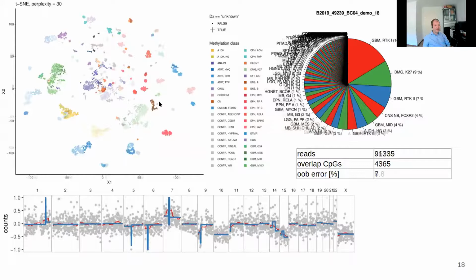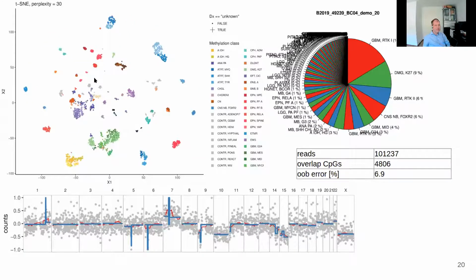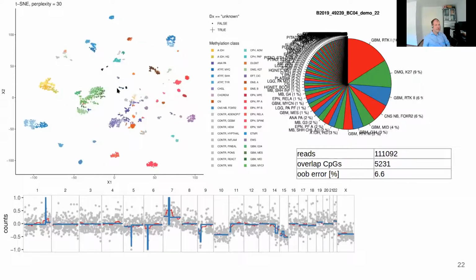And that's the same reference samples that are used in the German Cancer Research Brain Tumor Classifier Center. And in the end, you end up with a diagnosis with a copy number plot: chromosome 7 EGFR amplification, P16 deletion, loss of heterozygosity of chromosome 10, and here that green cloud would be glioblastoma IDH wild type RTK1, as it is also depicted independently by the random forest classifier.